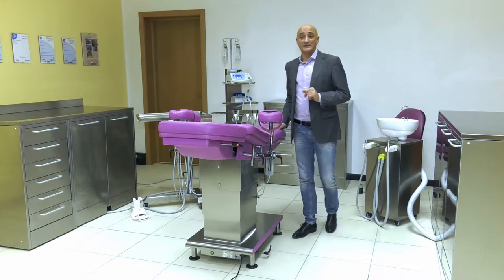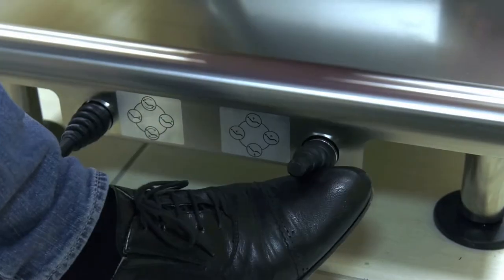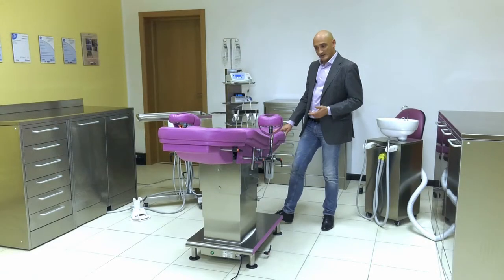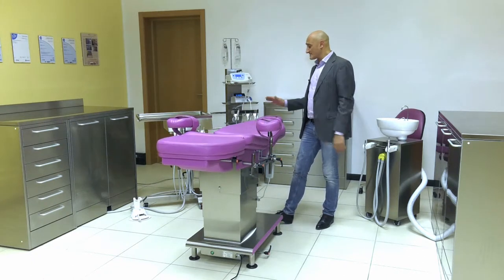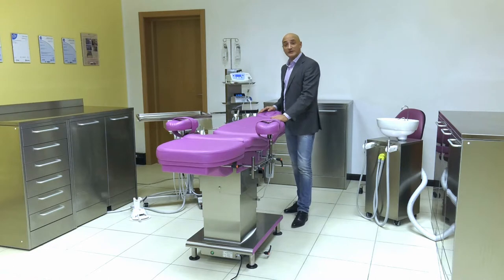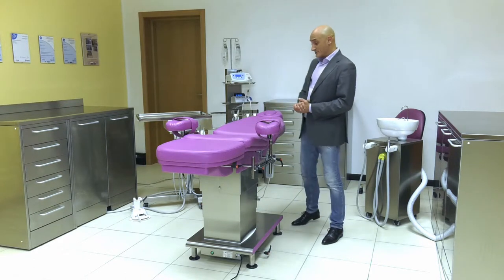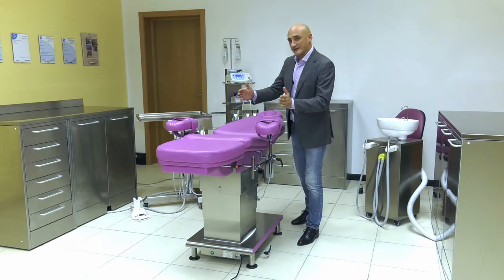Another very important thing you will have noticed is that in the lifting or lowering movements of this chair, or on the footrest or the Trendelenburg position, the axis of the patient's head is always in the same position. This is possible thanks to the movement of the four motors, which would be totally impossible in a standard chair, because a standard chair has a pantograph system to permit all the various movements, and this moves the patient's head forwards or backwards.